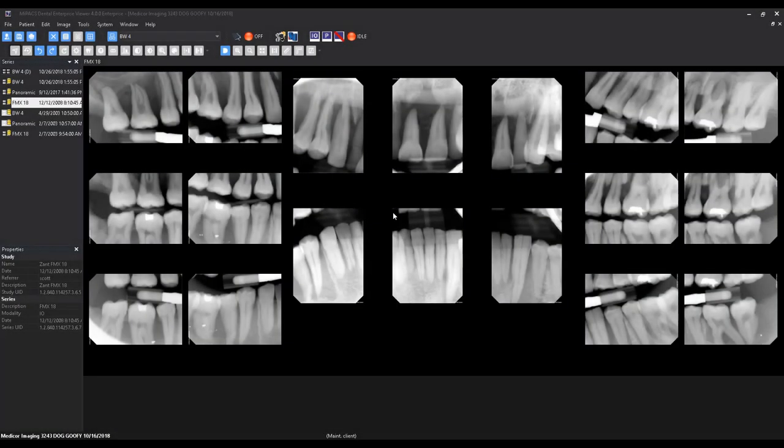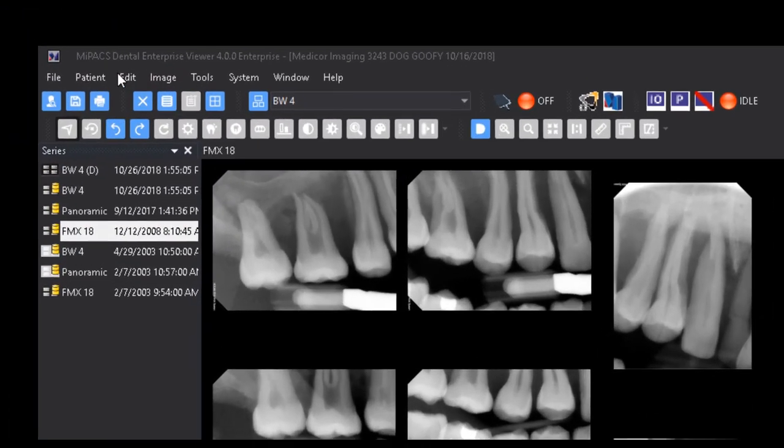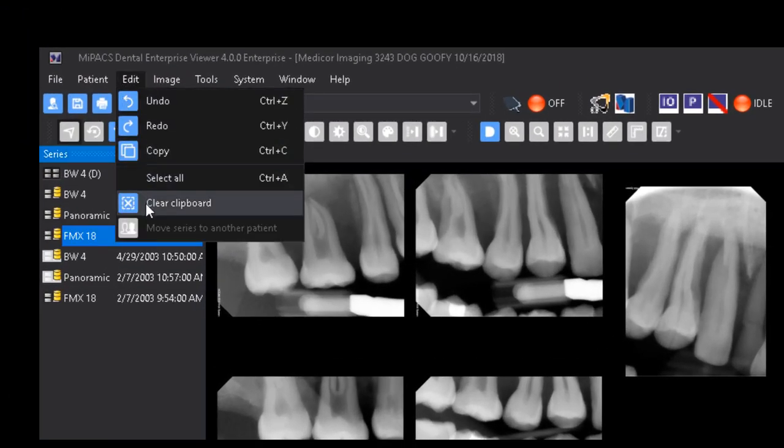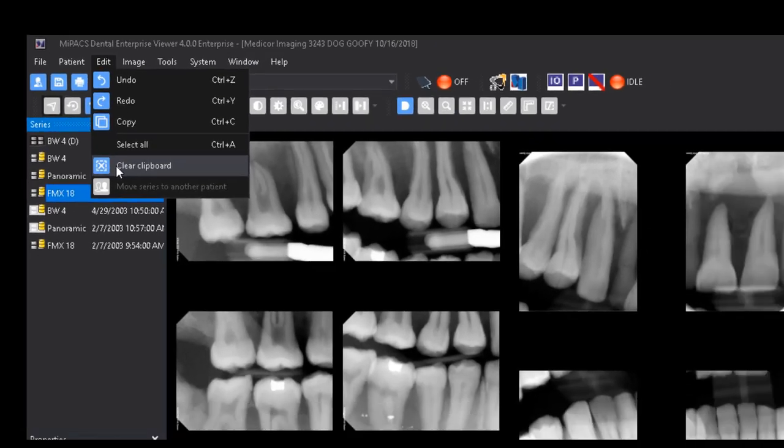There are a couple of different ways to compare series in the MyPax viewer. The first is the presentation overview mode. The presentation overview utilizes the clipboard to select which images you would like to use. Because of this, you will want to first clear the clipboard before selecting any images to use. Select Edit Clear Clipboard from the menu to remove all images from the clipboard.